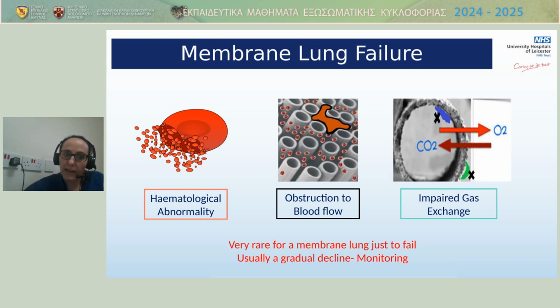The other thing it can cause is hemolysis, which, again, if you look in the Red Book, is the destruction of red blood cells. This is very bad for the patient's prognosis, particularly with regard to kidney damage. So we need to be aware of this.